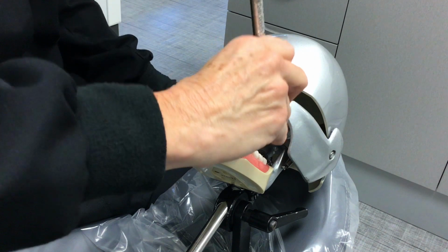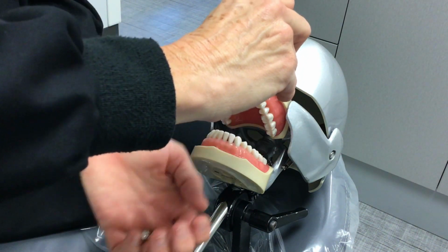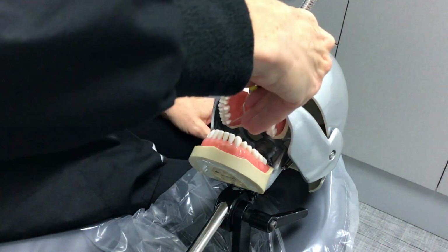The next thing that you're going to do is take your palm and turn it down, so you can see your palm is pointing down toward the floor. Then the last thing you're going to do is go ahead and place your fulcrum.